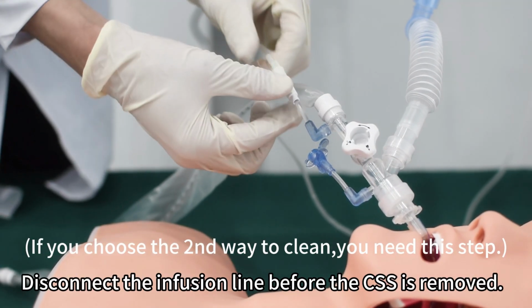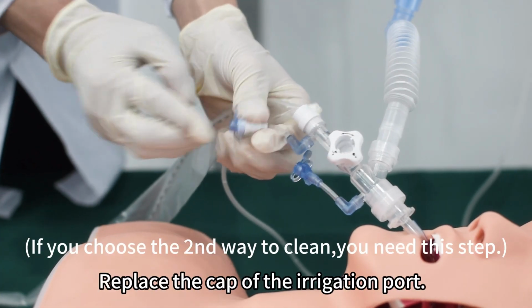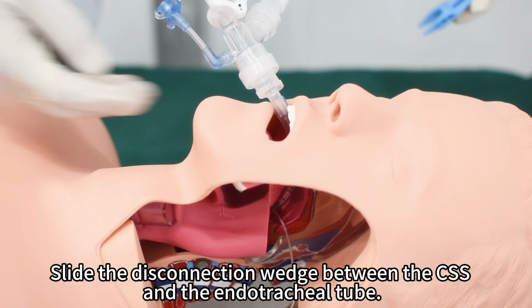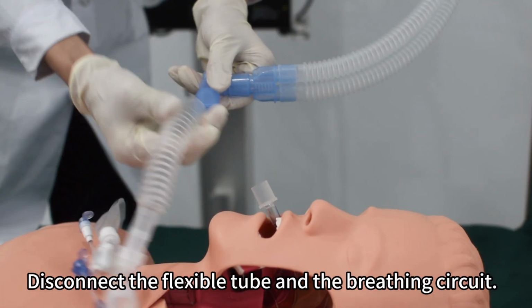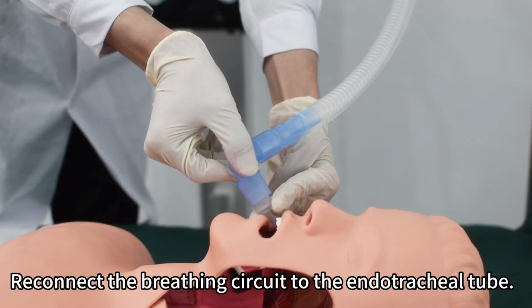Disconnect the infusion line before the CSS is removed. Replace the cap of the irrigation port. Slide the disconnection wedge between the CSS and the endotracheal tube. Disconnect the flexible tube and the breathing circuit. Reconnect the breathing circuit to the endotracheal tube.